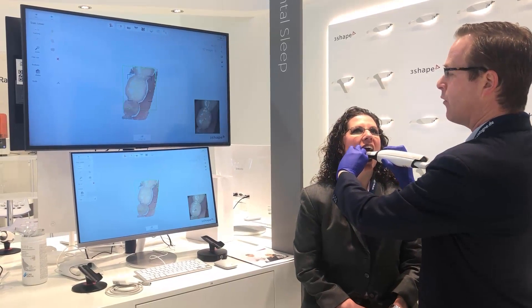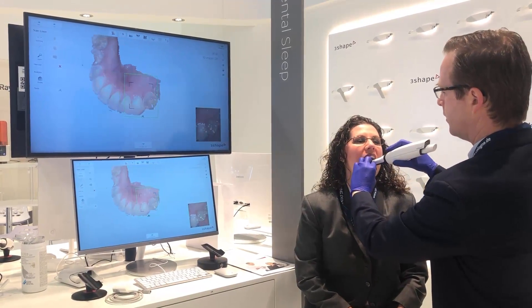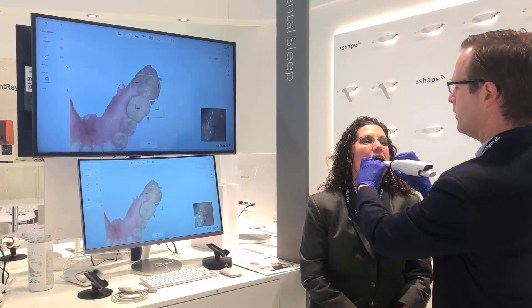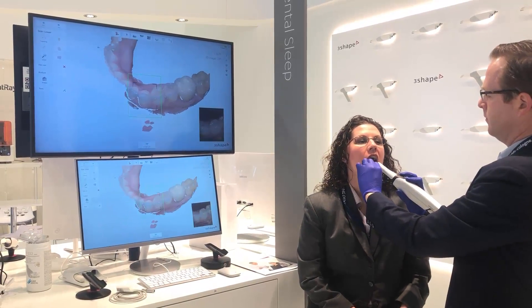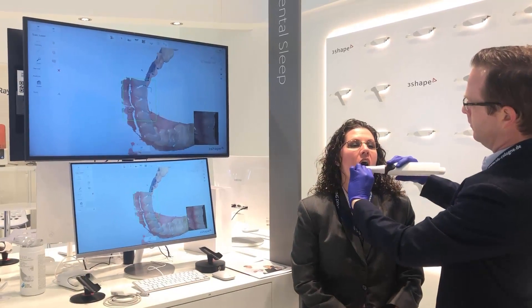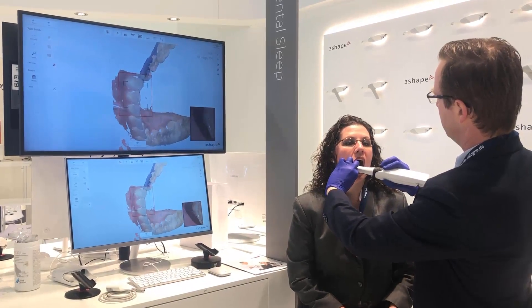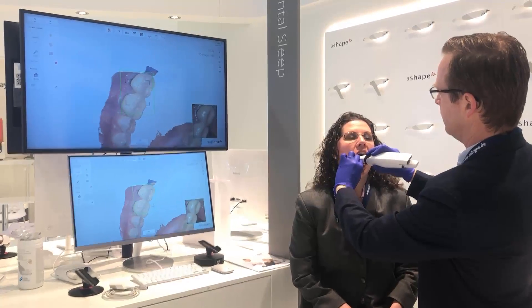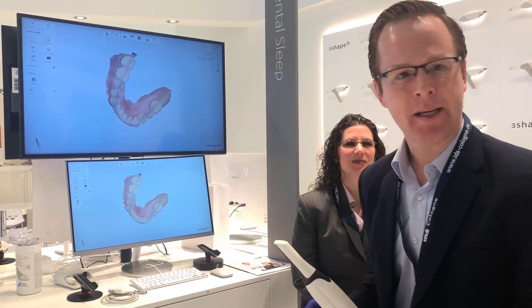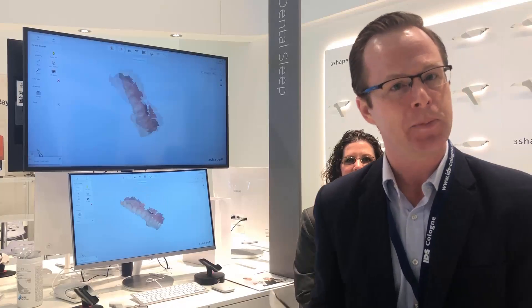I'm going to hover above the occlusal surface, starting very simple. And here we have it — 36 seconds. I can review the arch and the scan. I'm going to scan the opposite arch and then also capture patient-specific motion.